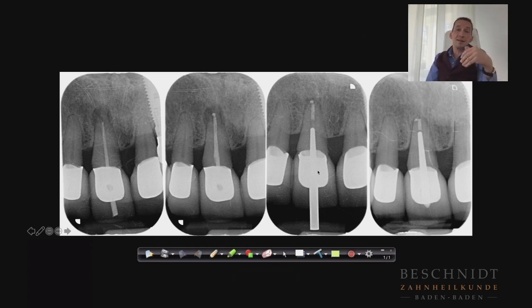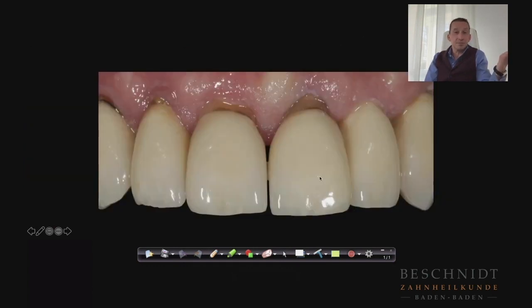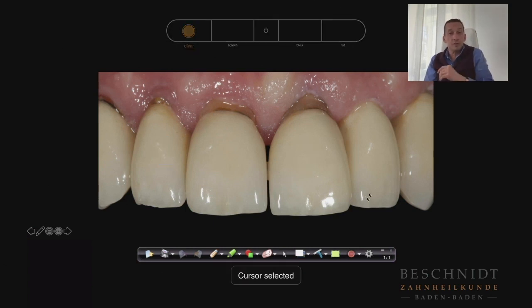So we said this is a temporary treatment. And after 2 additional years, she had resorptions, as you see here, and the anterior teeth had mobility grade 3. So we decided to place 2 implants and a bridge. This implant and this as an implant, and we wanted to do this with a full digital workflow.